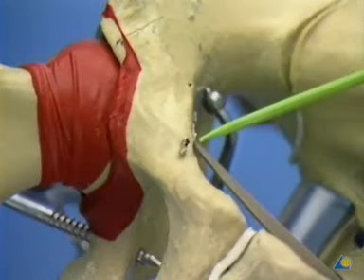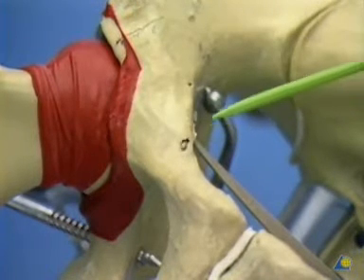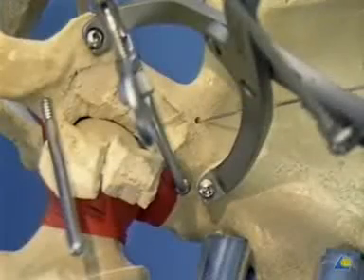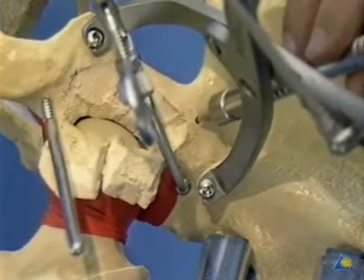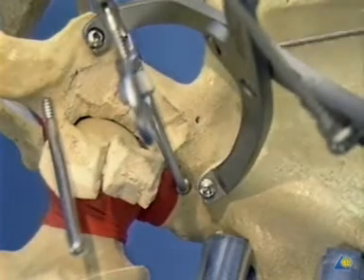An ideal direction of the drill bit that follows the axis of the anterior column is not possible through the Kocher-Langenbeck approach. The depth is checked and a 3.5 millimeter cortical screw inserted.